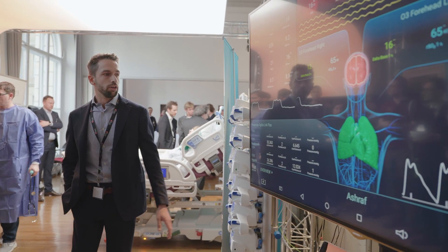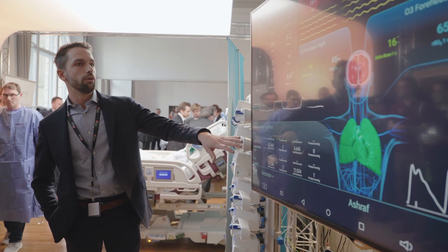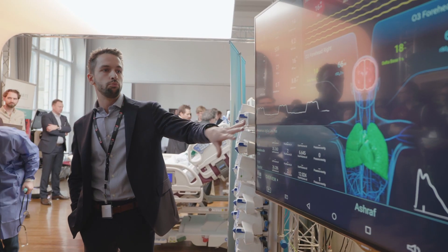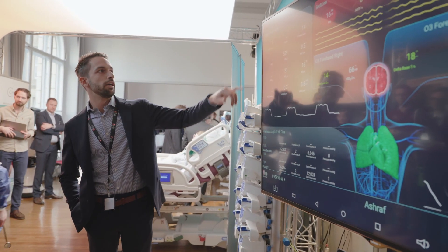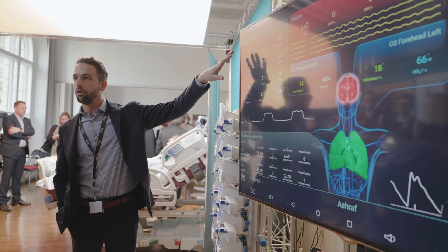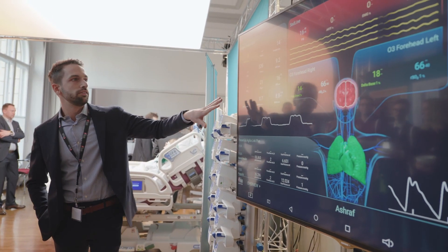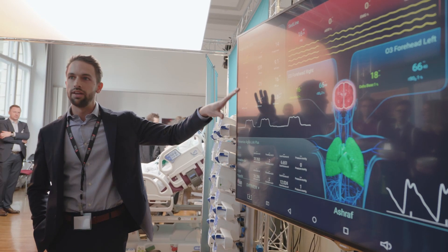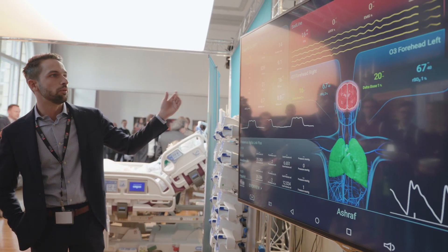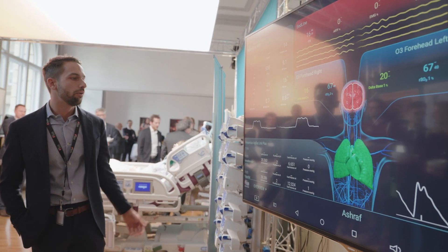Right now you can see a pretty nice display of the Draeger ventilator and see exactly what the ventilator status of the patient is right now.